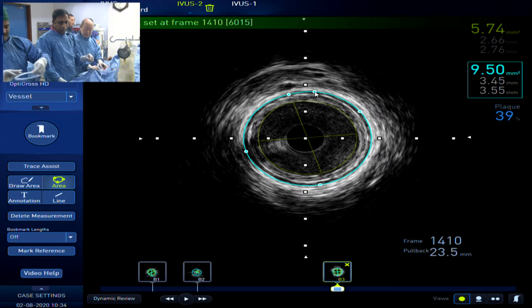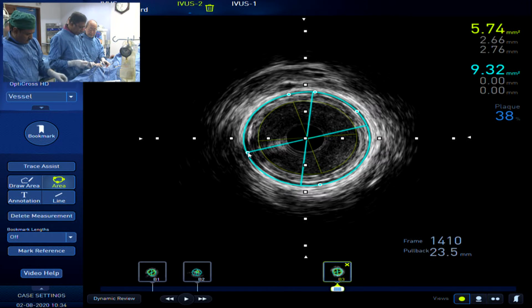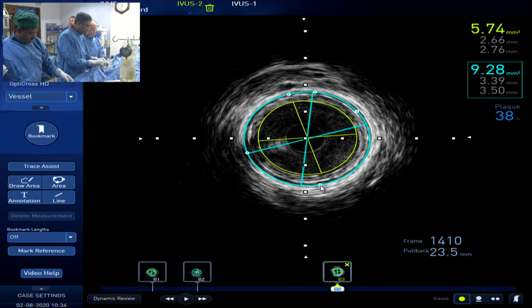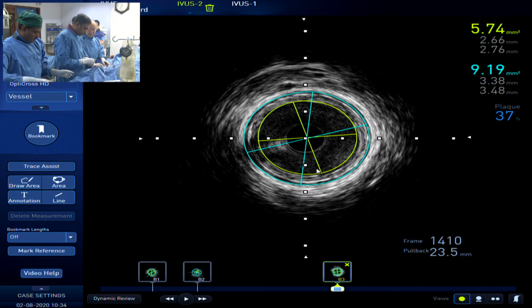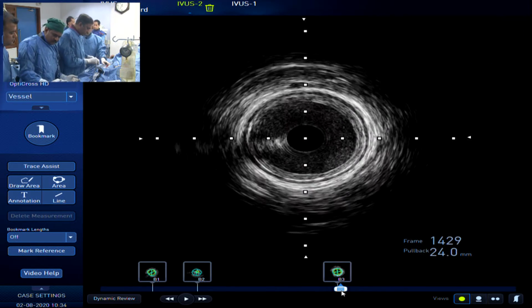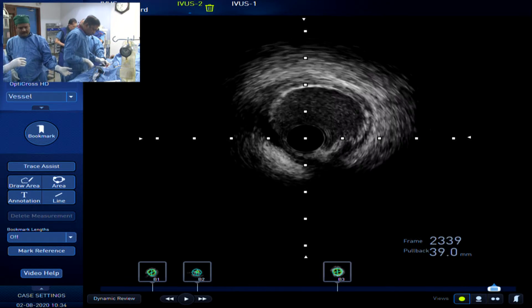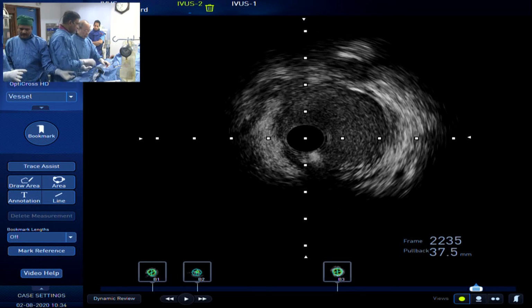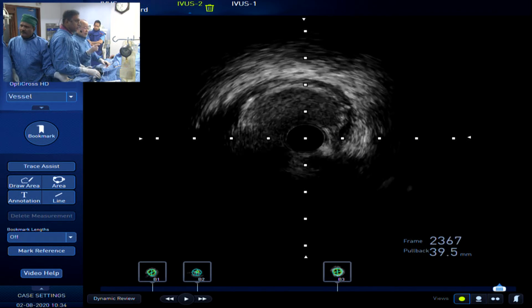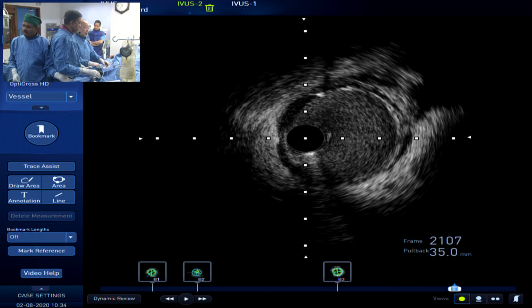Dr. Saito, I'm sure you use a lot of intravascular imaging, and in this case ultrasound. With your CTO practice, with your risk of perforations and pericardial effusion, how often have you picked up the effusion with the intravascular ultrasound? First of all, we are not so much afraid of wire perforation. If it is limited to the guide wire, it's not a dangerous situation.